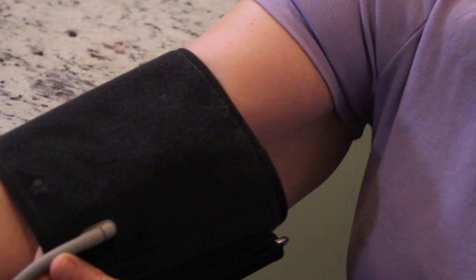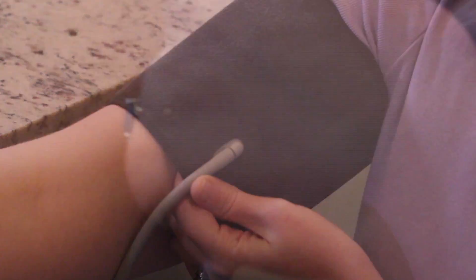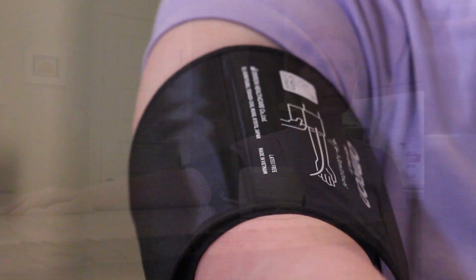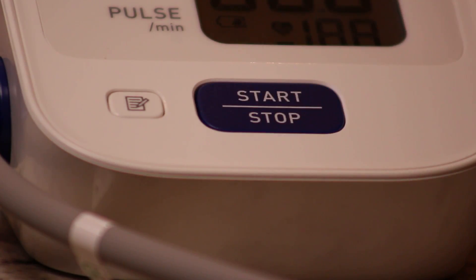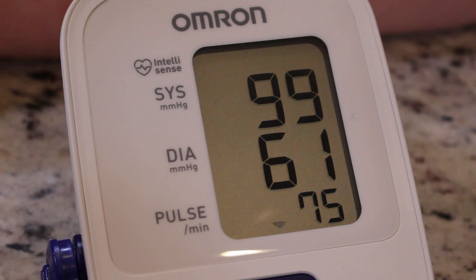Third step, place the blood pressure cuff on the bare skin of your upper arm with the bottom edge of the cuff a half inch above your elbow. The air tube should rest on the inside of your arm. Wrap the cuff snugly and rest your arm on the counter so that your hand is at about the same level as your heart. Press the start button. It's important to be still while the machine is working. When the machine is finished, the pressure will release and your blood pressure and your pulse will appear on the screen.